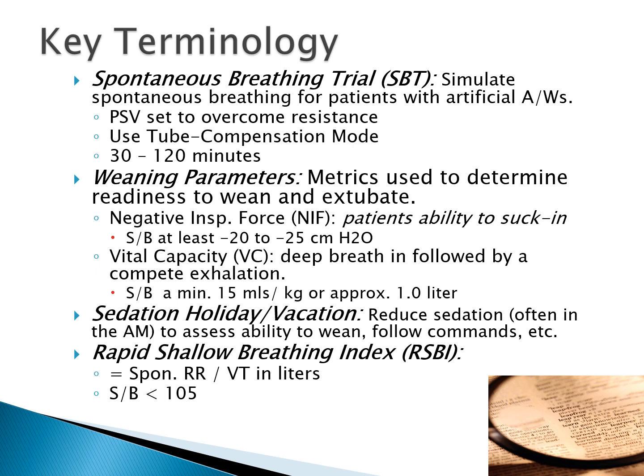The standard of care is still to do this for 30 to 120 minutes, so 30 minutes to 2 hours, if they can tolerate it, of course. If they show signs of distress, the patient should be returned back to full support, to assist control or pressure regulated volume control, dual mode, or whatever your full support mechanism is. That's pretty much the standard. What the more recent data is showing is that you're going to pretty much know in the first 30 minutes or so. So while it's not irresponsible to do it for up to 2 hours, for a lot of patients, you're going to know they're going to tolerate it.